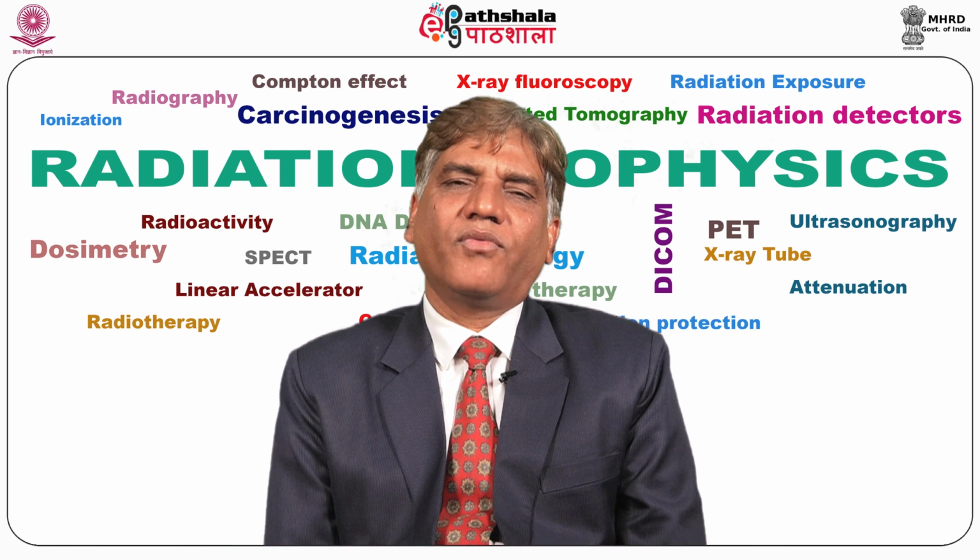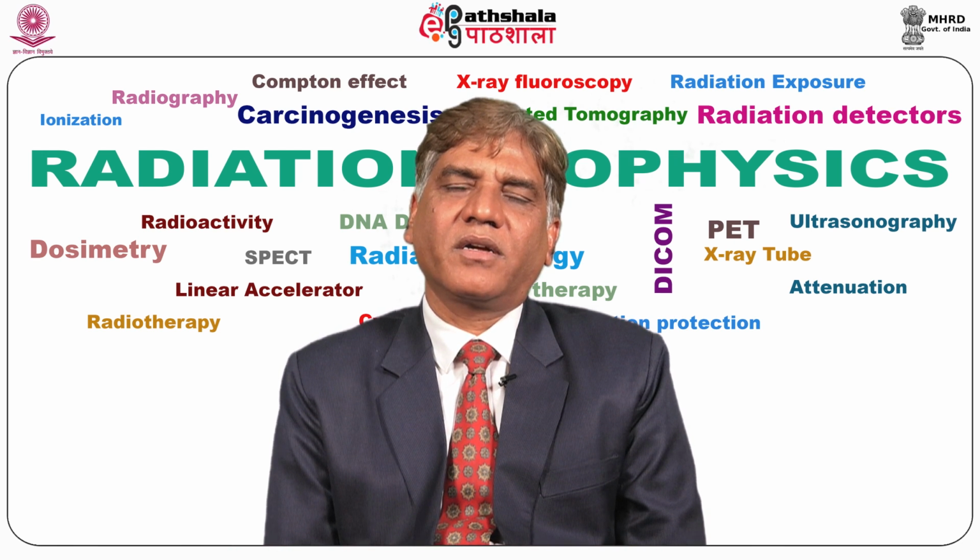So, how does the TFT work? As you can see here in this figure, during exposure the TFT is switched off, and charge is accumulated and stored.